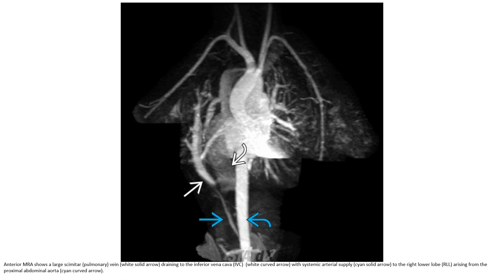MRA shows a large Scimitar vein draining to the inferior vena cava, with a systemic arterial supply point to the right lower lung arising from the proximal abdominal aorta.